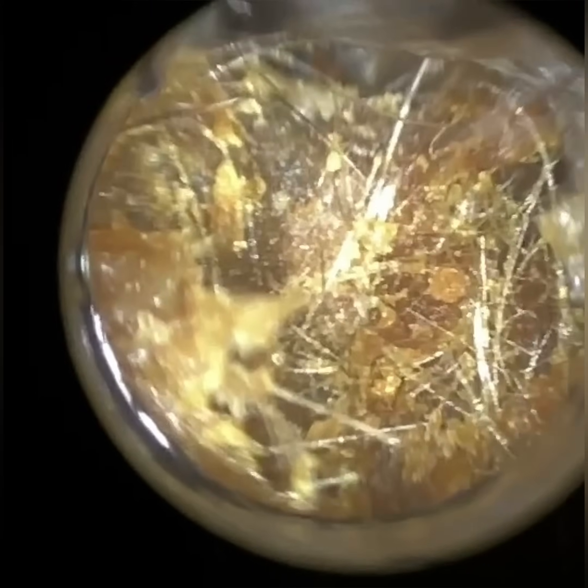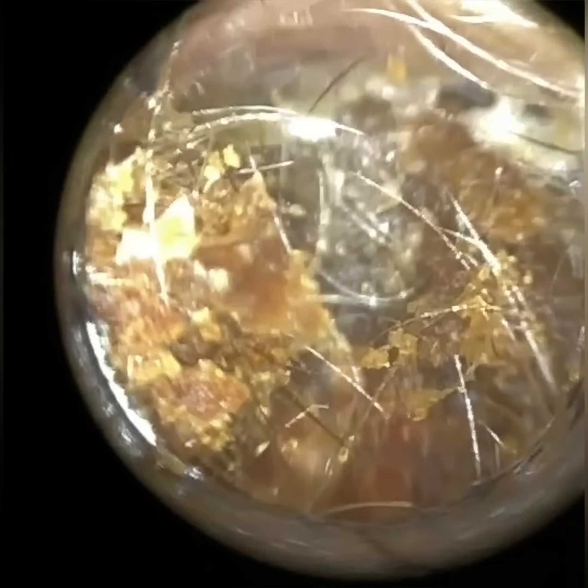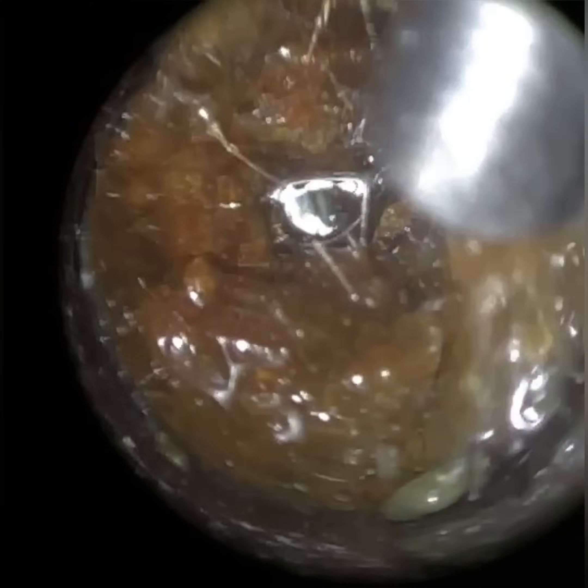When I first started developing the speculi, I did some market research. I used to perform earwax removal using a speculum with a microscope or head loupes before switching to the endoscope. I wanted feedback from people who do it day in, day out about the most common speculum size they use — the answer was 5mm. But the more I've performed the procedure with a speculum, I actually prefer the smaller size. I've just inserted the hook at the roof of the ear canal, but it dissected through the wax plug rather than retrieving it, so I've applied some olive oil spray to change the consistency and help loosen the wax.